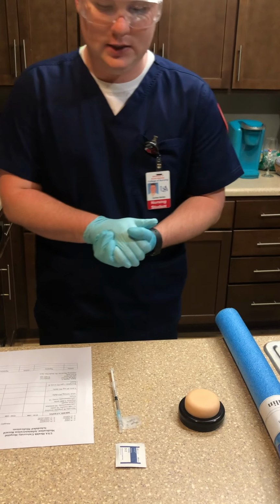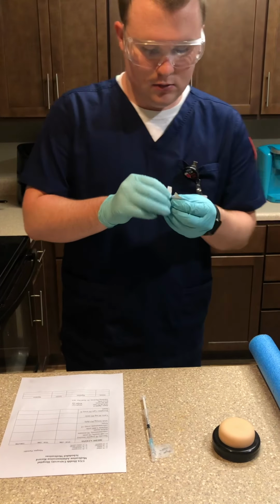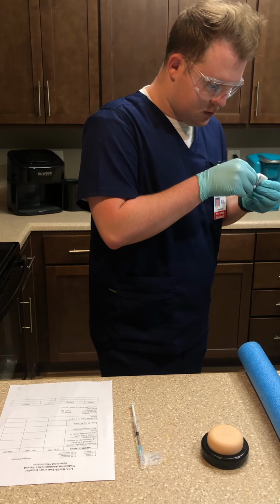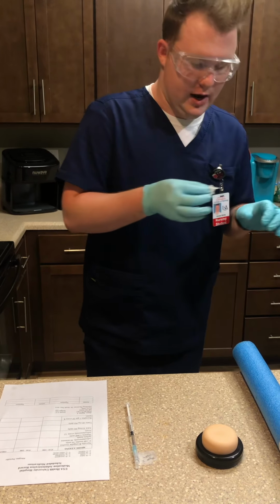So now what I'm going to do is I'm going to take my alcohol pad, okay, dispose of it in the trash.